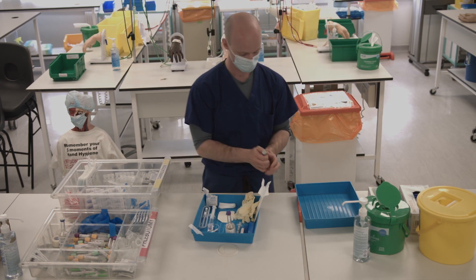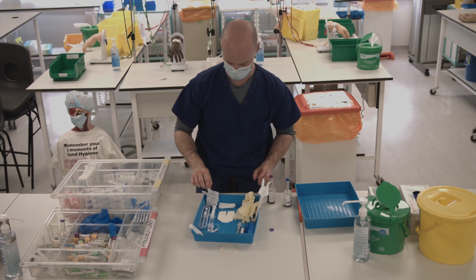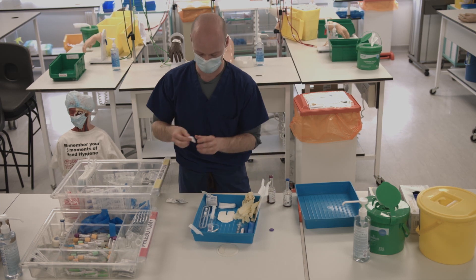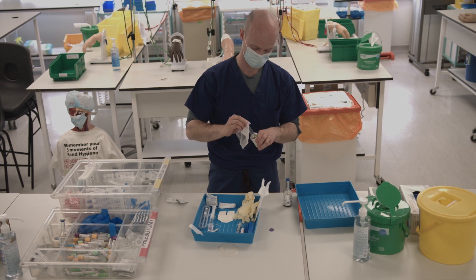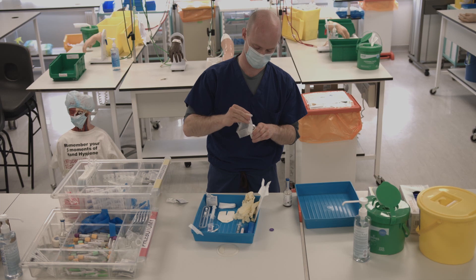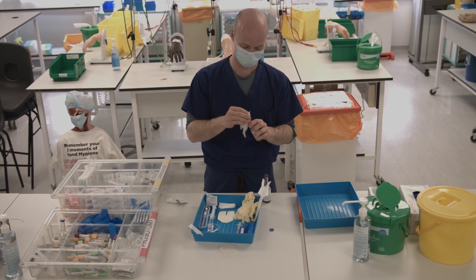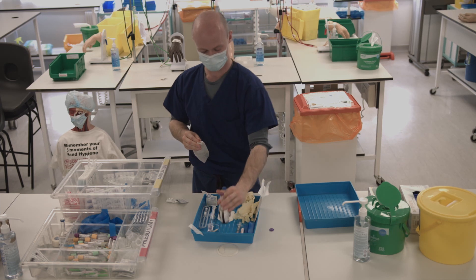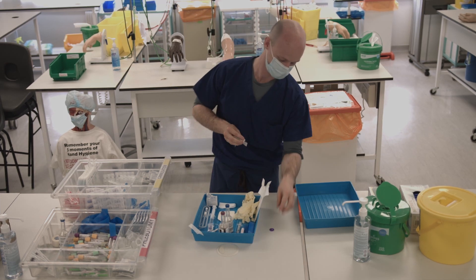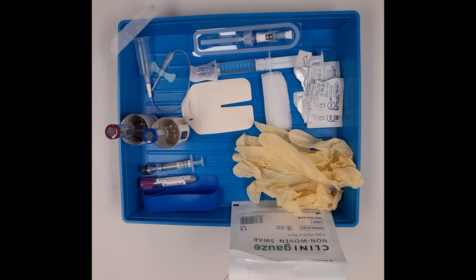Remove the tops from the blood culture bottles and wipe the top with different areas of the chlorhexidine. You are now ready to go to the patient's bedside. This is how your tray should look as you approach the patient's bedside.